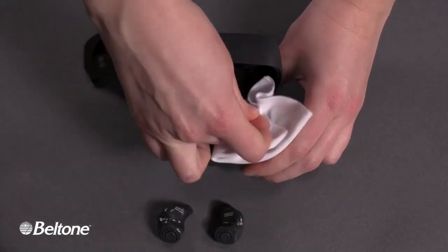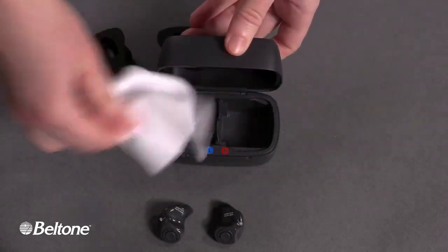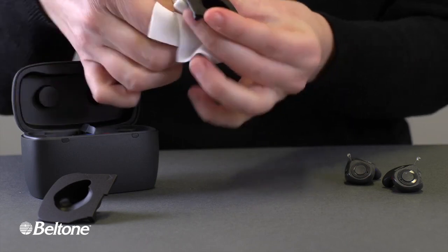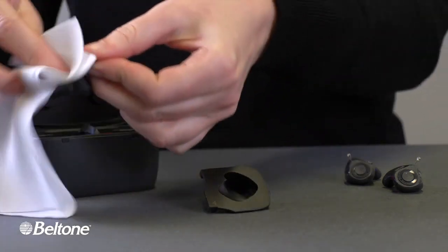Taking a white cloth, the demonstrator wipes both compartments in the case. He uses the white cloth to thoroughly clean the two charger inserts in both charger holders.